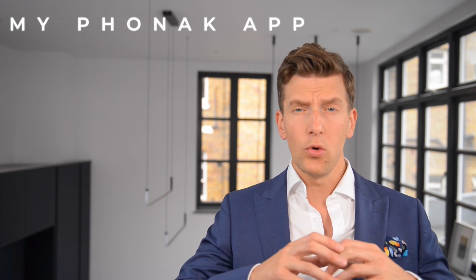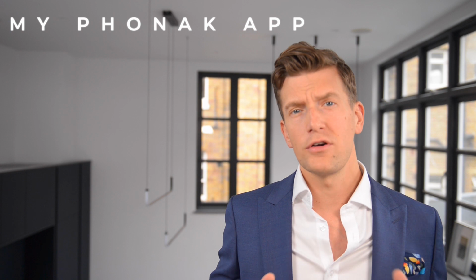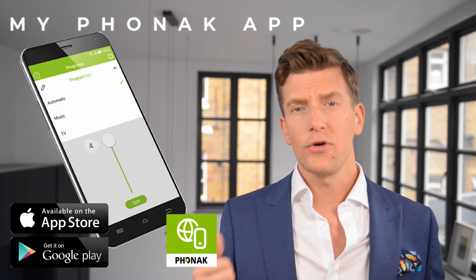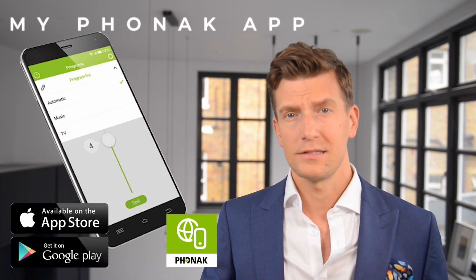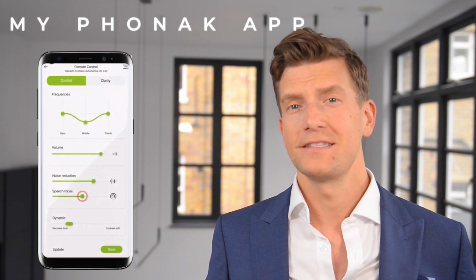Each manufacturer has its own app to work with their Bluetooth hearing aids, and to cover all of those features is worth a video in itself. But to give you a brief overview, if you have an iOS or an Android device, you can download the app, and it allows you to make adjustments to the volume of the hearing aid. It allows you to access different programs on there as well, without having to press the button on the back of your hearing aids. Not only that, but the myPhonak app allows you to adjust some finer details as well.